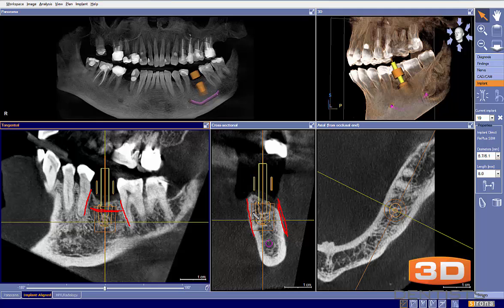There's definitely a little bit more room to the buccal than the lingual, but there's a reason for that here. So that looks pretty nice as well.